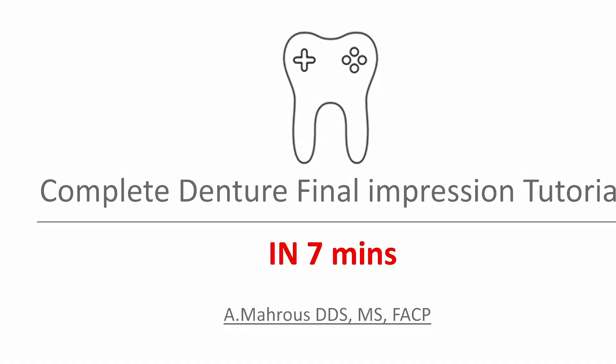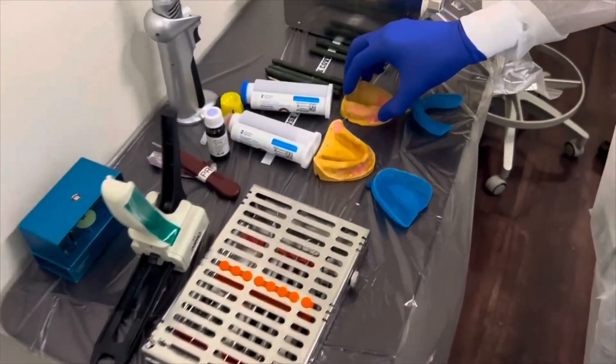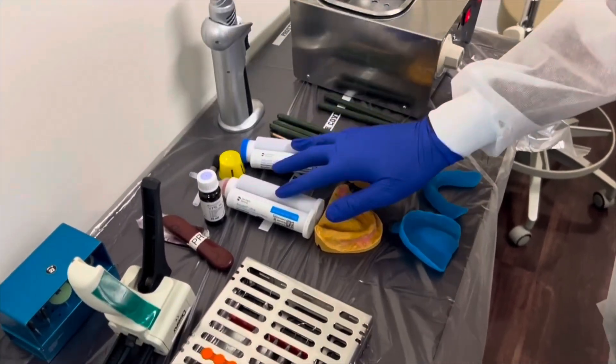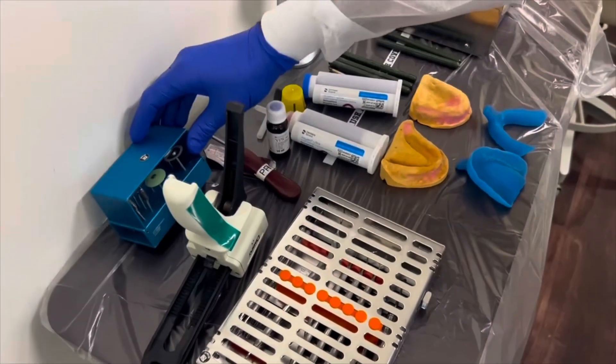Hello. In this video we'll go over our impression making technique for complete dentures using PVS and green stick compound. We have our diagnostic casts, our custom trays, our hot water bath, a torch, our PVS impression material and green stick compound, waxing instruments, and a straight hand piece with its tools.